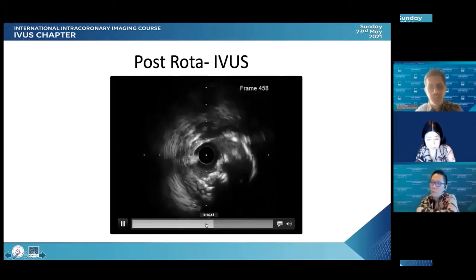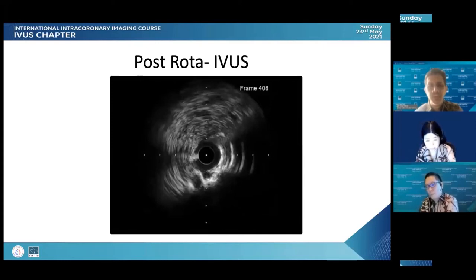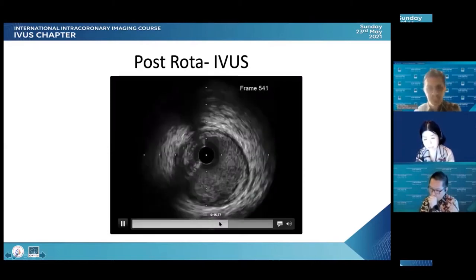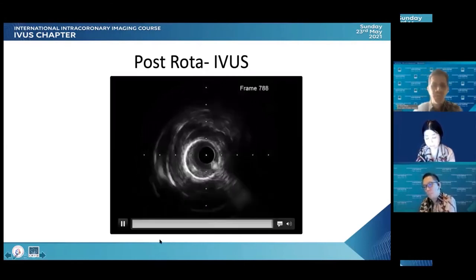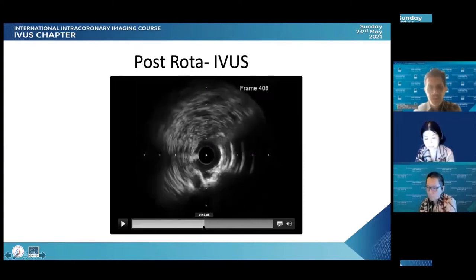That one here. Yeah. So at 3 o'clock you see the nice shape, which is concave. And then behind, you see the double layer or even one more layer. So that's really reverberation. And when you see the reverberation after the rotor, that's indicating that you polished the surface well, because after polishing the surface, ultrasound can reflect much more than without. We always see the effect of the rotor at the site of the wire bias, where the IVUS is located. So you should look at where the IVUS is located. If you see this type of reverberation, you did a good job. Originally, you remember the calcified nodule is convex and protruding into the lumen. But now you see some kind of hole here. That's very different compared to before.